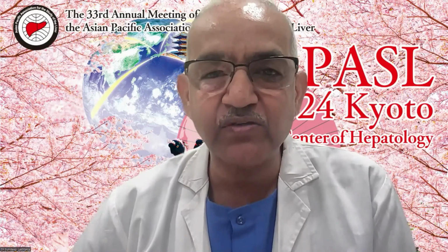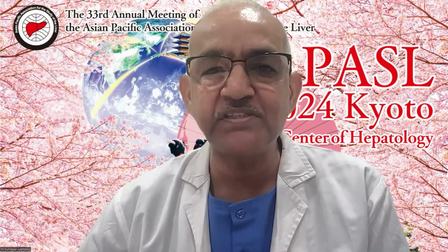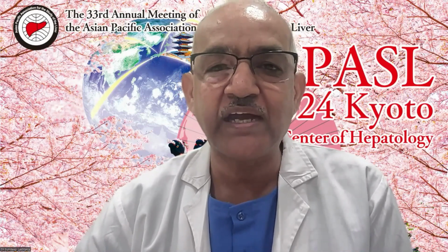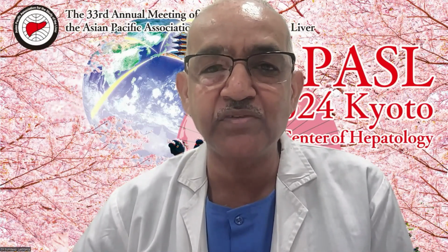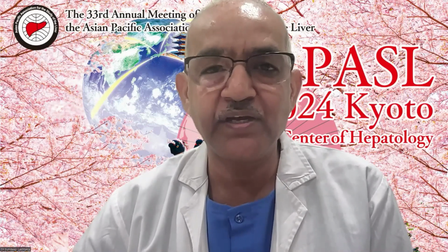Thank you so much. Yeah, I would actually add to that, the cost of the treatment by EUS is much cheaper than IR, because the interventional radiology per se is more costly. Their technical cost is more, and time and radiation are also much more, whereas we can do the entire procedure even without fluoroscopy or with limited fluoroscopy. In India, the coils are not very expensive. Each coil costs about $100 maximum. Yes, more or less. Thank you so much.